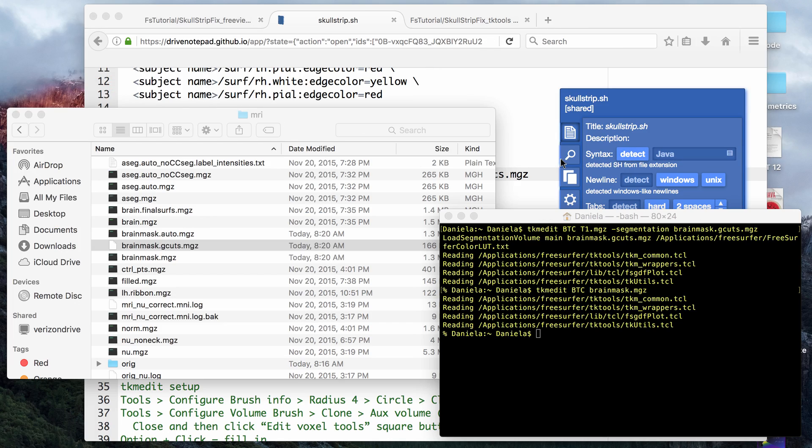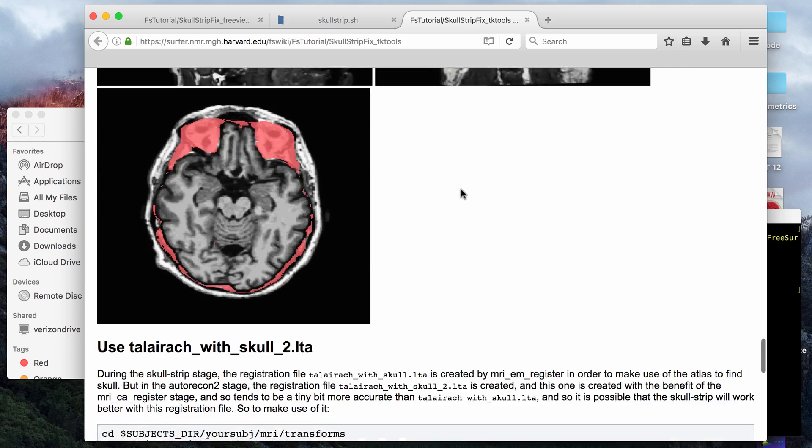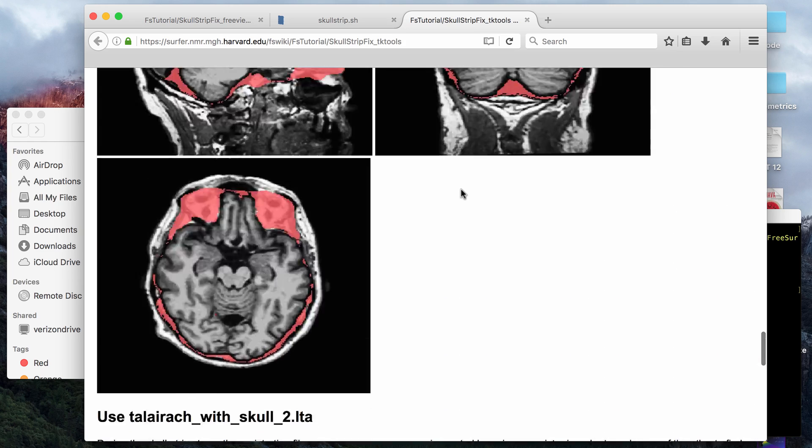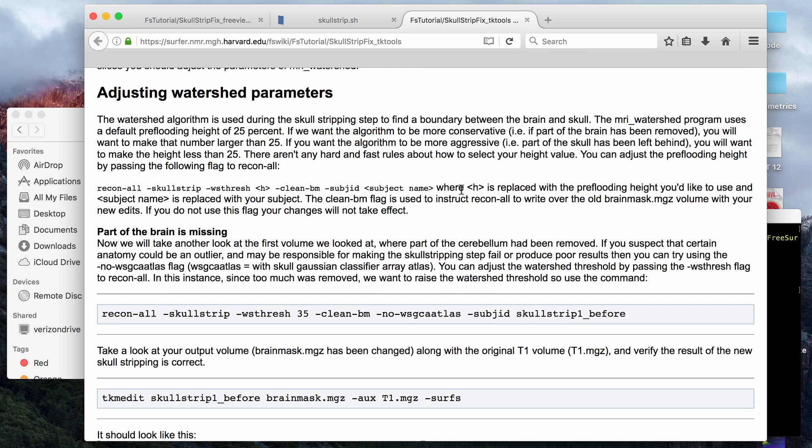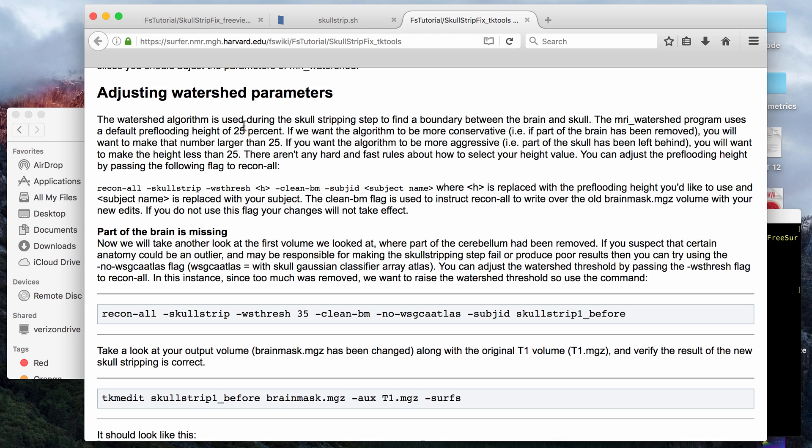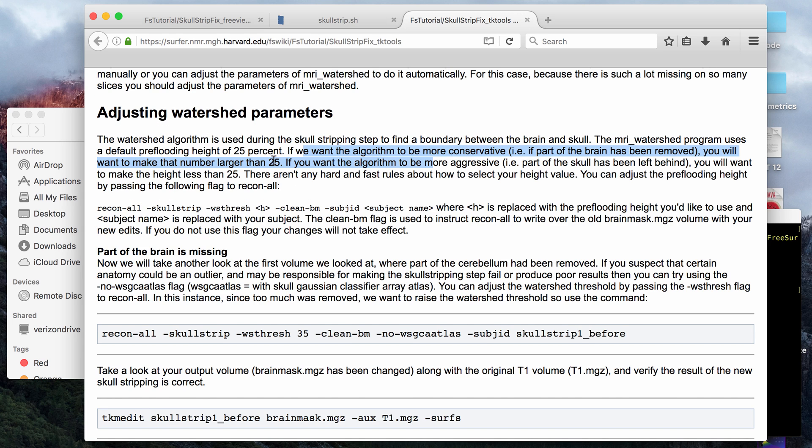And then the last thing I'll show in this video is how to change the watershed parameters. The technique that FreeSurfer uses to get a skull strip is called a hybrid watershed algorithm, which is basically based on doing an inversion of the intensities of the brain and looking for the separation between the brain and CSF. The separation is based on something called a pre-flooding height, which the default value for the pre-flood height is 25, which stands for 25 percent. It says here if you think that too much of the brain was removed, you want to use a value larger than 25.